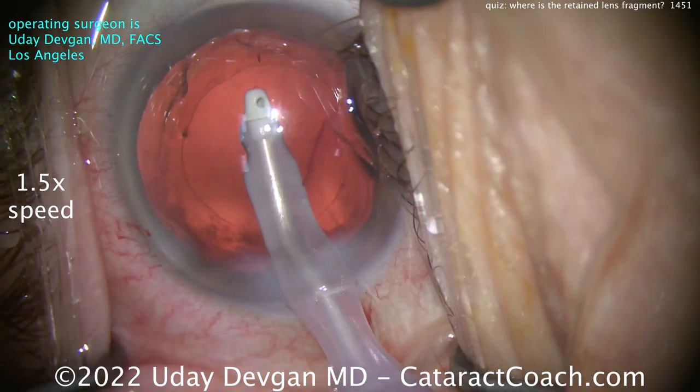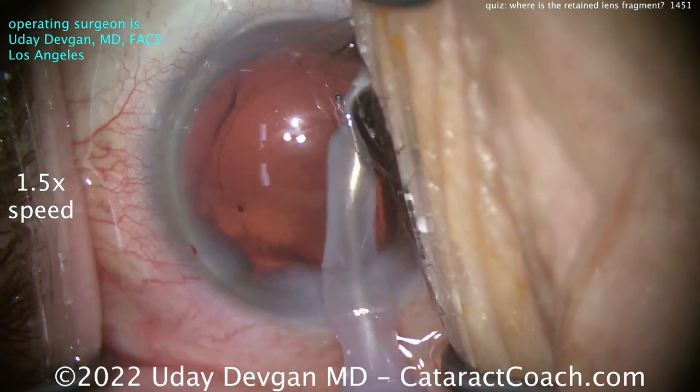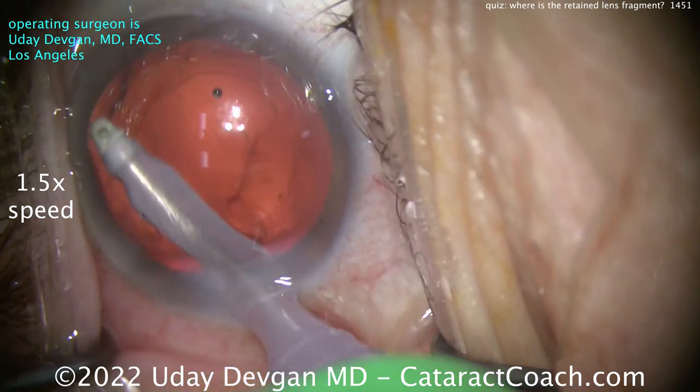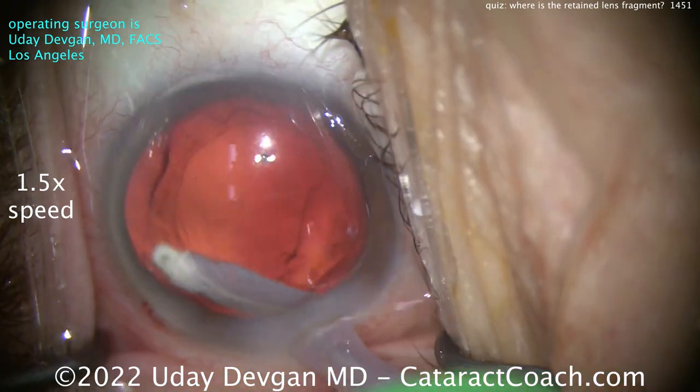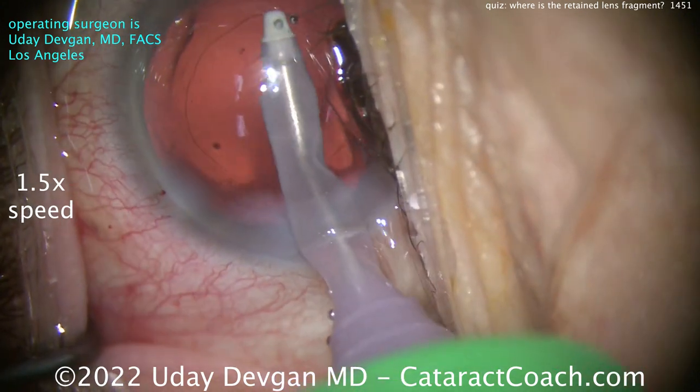I don't want any excuses for why you couldn't find that last piece. It all looks pretty good, right? A little viscoelastic there. Let's polish up the undersurface of the lens capsule — we've got flow at least 40 cc's a minute, so we're flowing a lot of fluid through the eye.